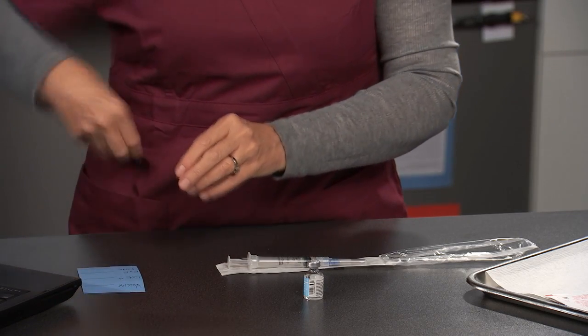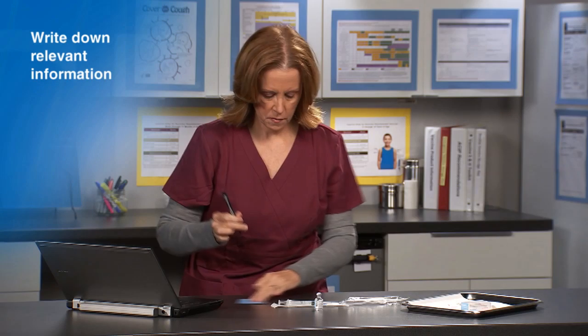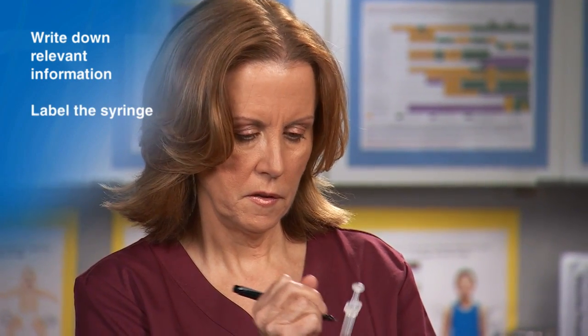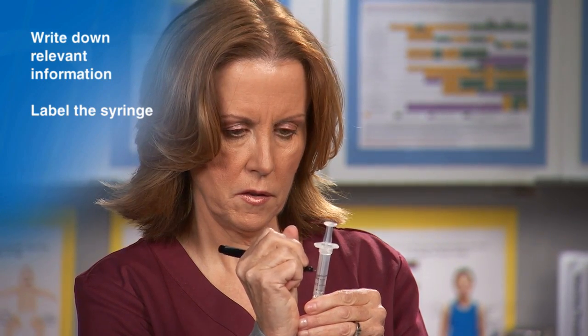If vaccine remains in the multi-dose vial, write down any relevant information needed for documentation, such as the manufacturer and lot number. Once in the syringe, many vaccines look alike, so label the syringe with the vaccine name or abbreviation.